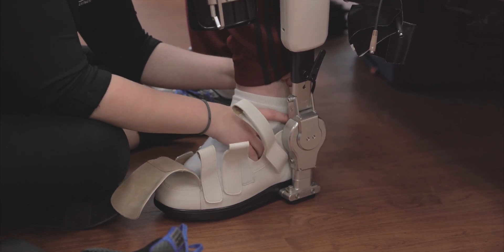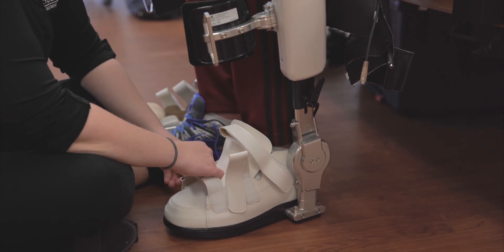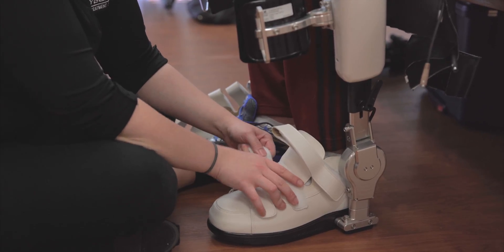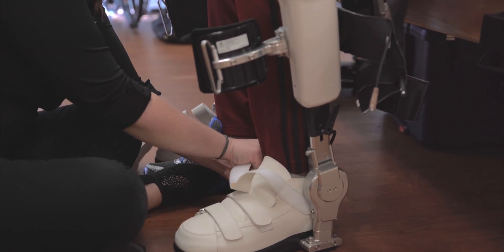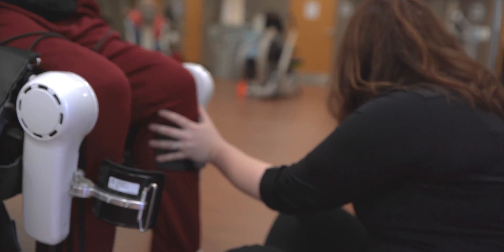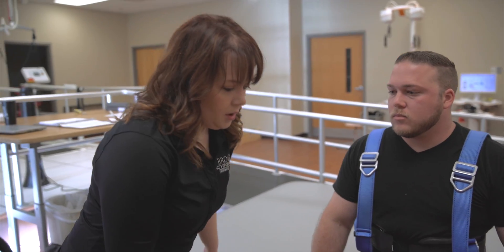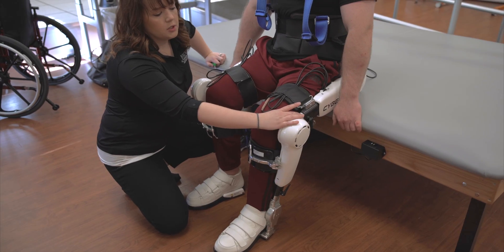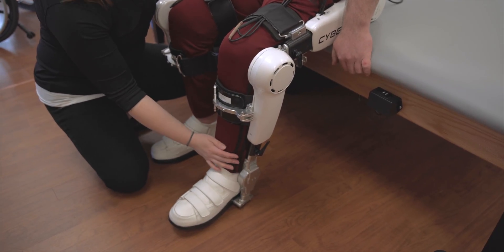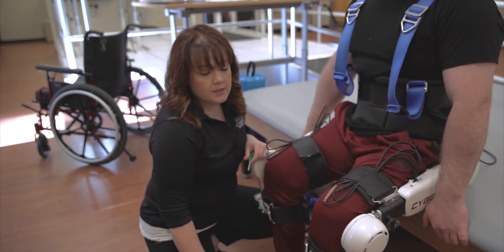We start by putting his feet in. The shoes have ground reaction sensors in them so it can sense weight shift while a person is walking, and that helps cue things as well when they're in certain modes in the robot. There are cuffs and straps for the lower leg and the thigh. Since this isn't Maverick's initial fitting, all the joints and everything are already set to him. It's adjustable at the hips in two places, at the knee, at the ankle and the foot in multiple places to help conform it to a person's specific body shape and size and the different angles that their legs might make.